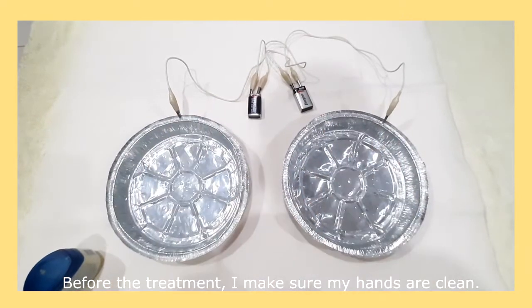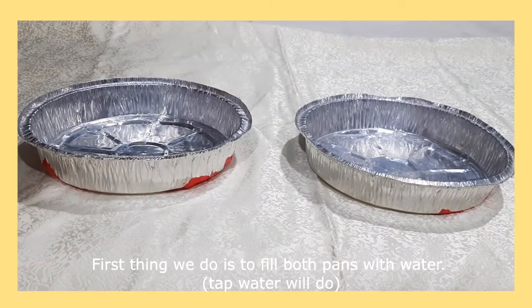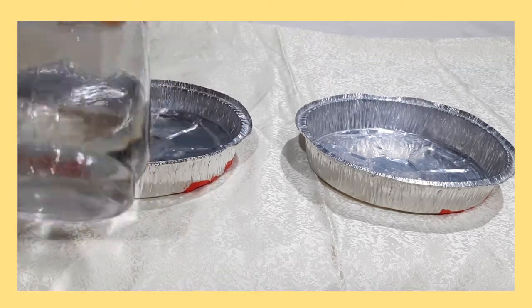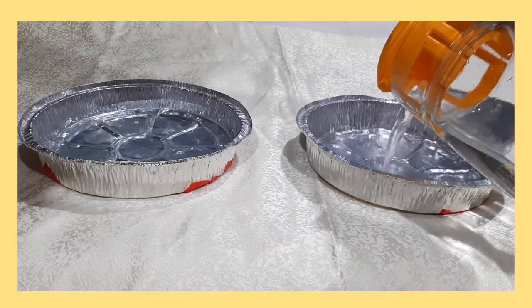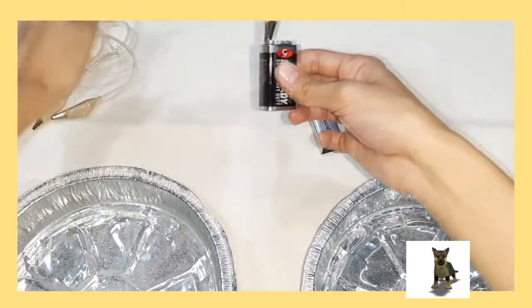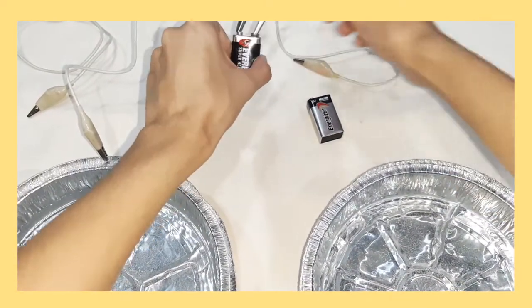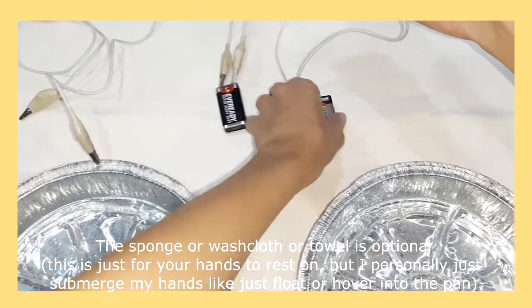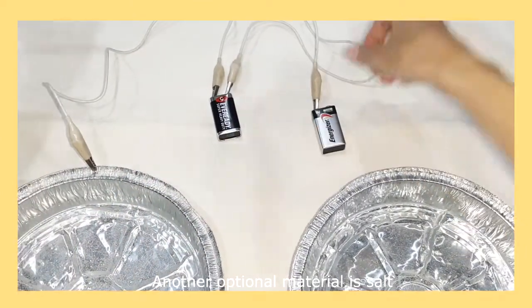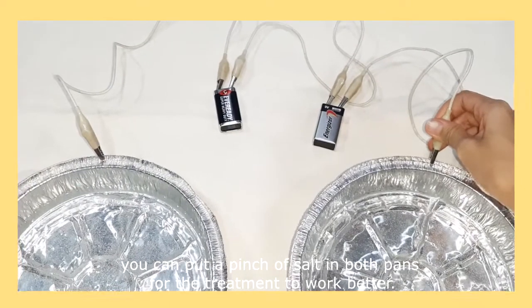Before the treatment, make sure your hands are clean — wash your hands and pat them dry with a towel. First, fill both pans with water, about three-quarters full so it doesn't overflow. Next, attach the alligator clips to the batteries and then to the pan — make sure to connect positive to negative. The sponge or washcloth is optional, but I recommend it so your hands don't touch the bottom of the pan. Another optional material is salt: if you feel your water is not conductive enough, you can put a pinch of salt in both pans for the treatment to work better.